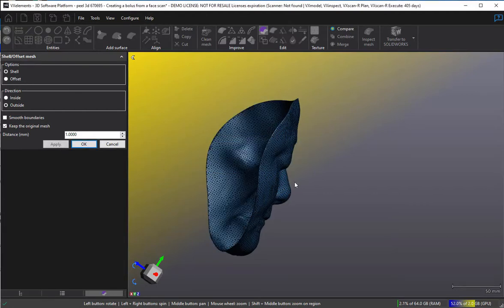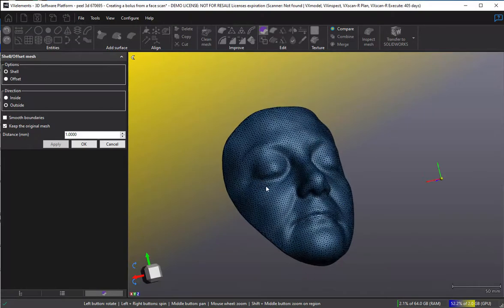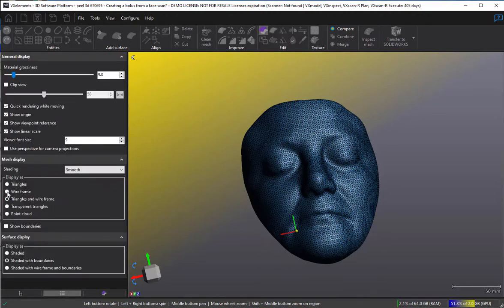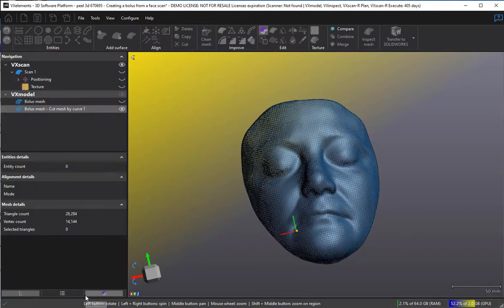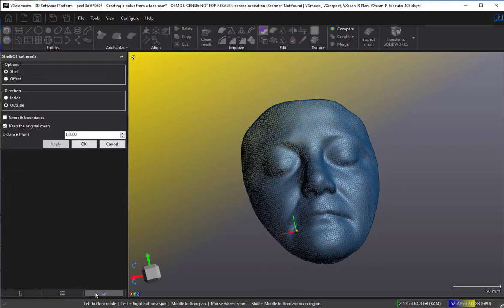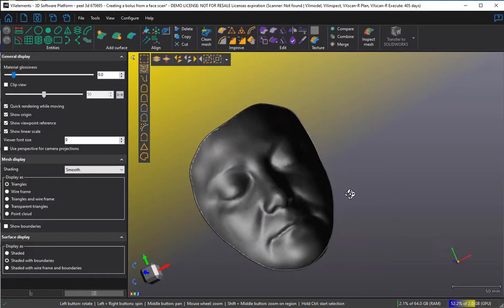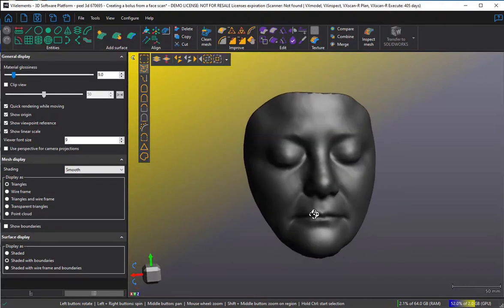We now have a double-thickness sealed mask — we actually have our shape. I'm going to briefly turn off the wire frame so you can see. There we have our accurate representation on the inside and our slightly expanded shell on the outside.